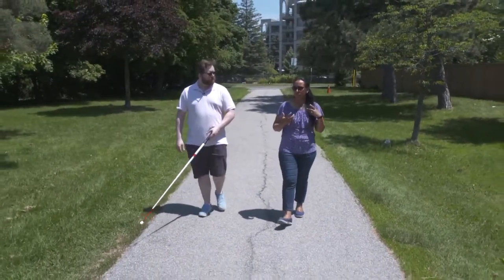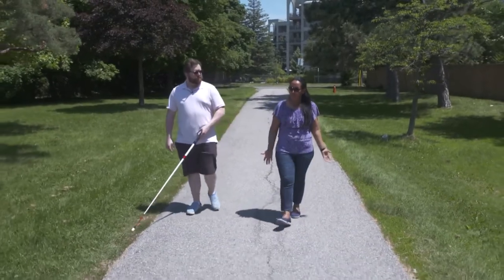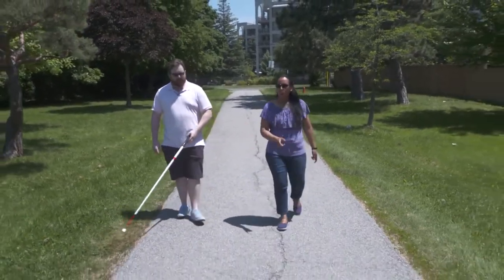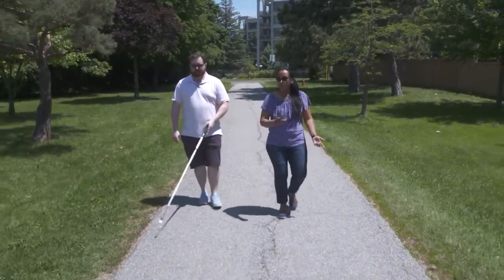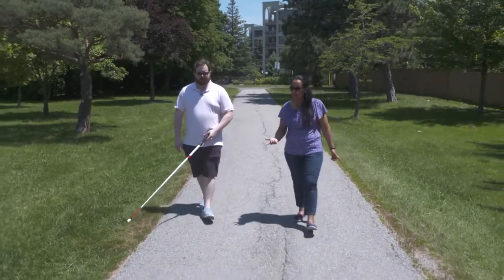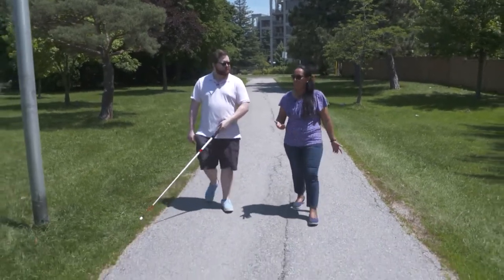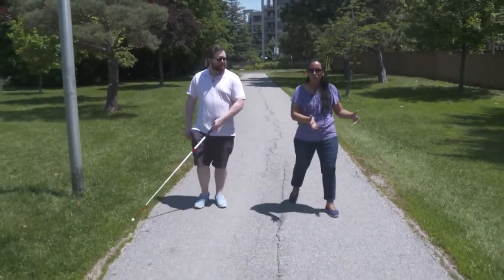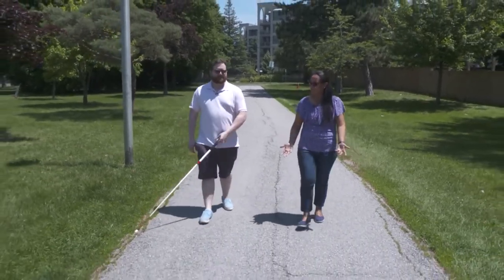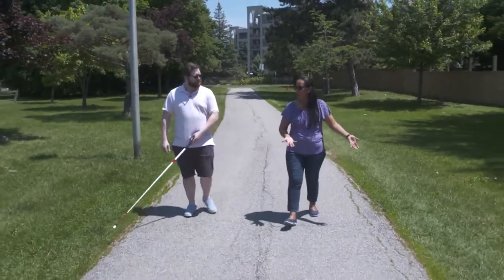Anita Laurinaitis: There are people who aren't always comfortable traveling in open space, so what they do is a two-point touch — touching the sidewalk, touching the grass, back and forth. You're doing this to maintain your alignment so you're not straying, especially on a busy bike path. It's a good idea so you're not straying into oncoming traffic.